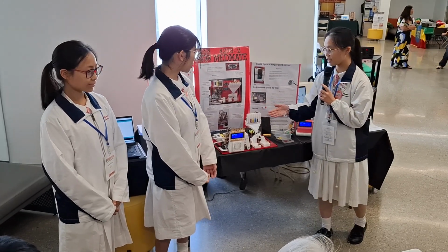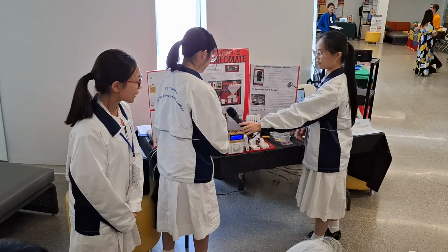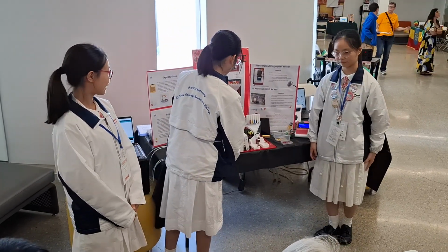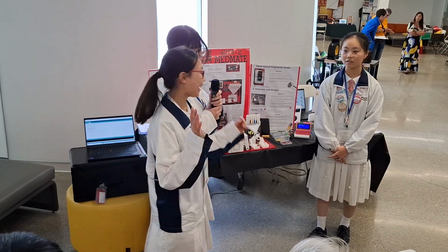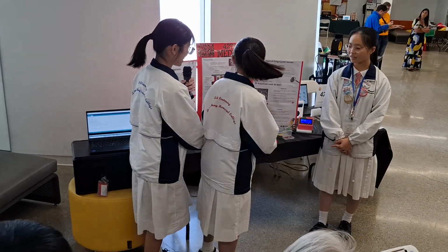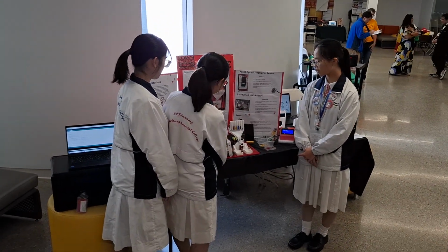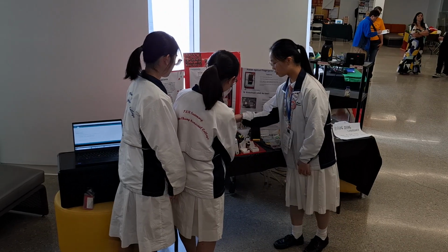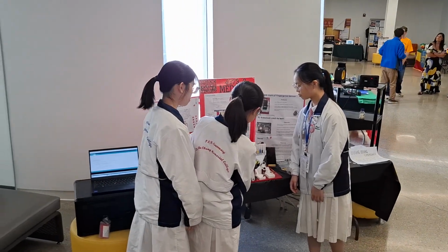It's time to take medicine. So it's time for medication. When a non-patient presses a finger onto the sensor, the machine will not respond at all, because she is not a patient. I am the patient, and I put my fingerprint on the fingerprint sensor. A little bit. Okay, it makes the green color.